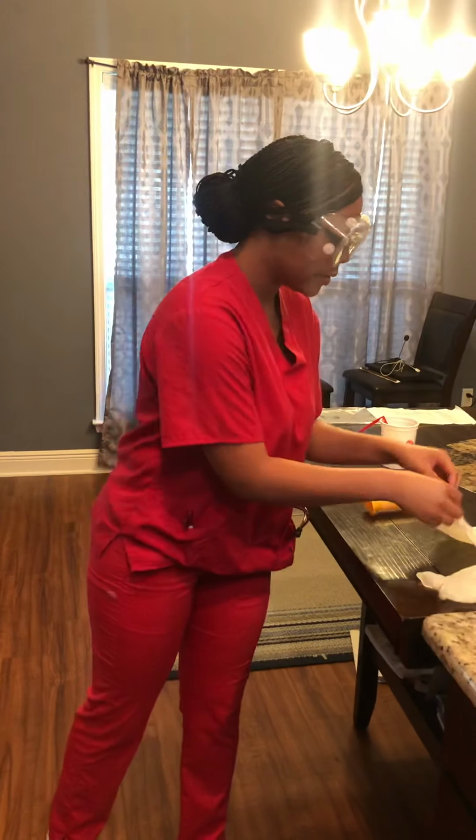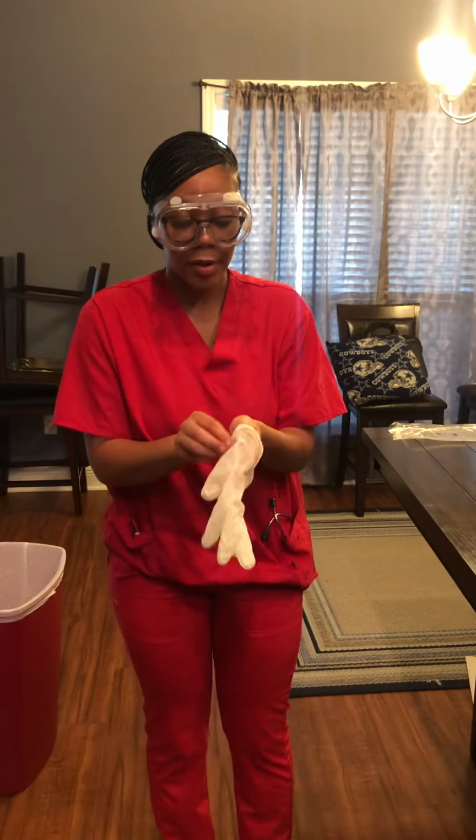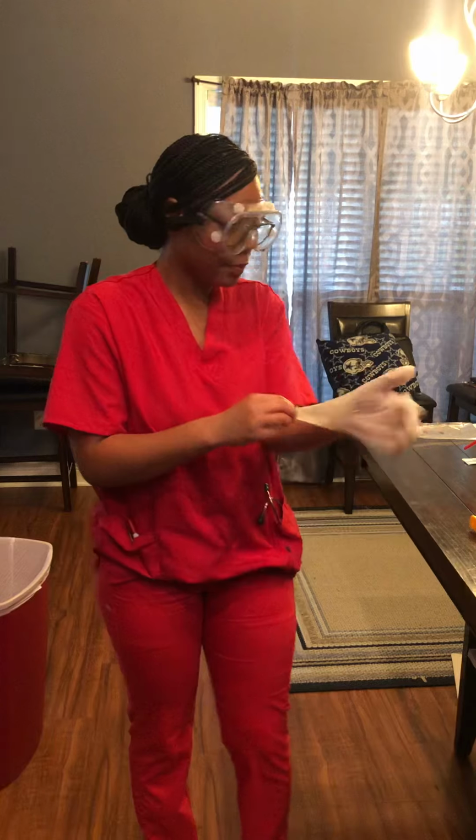For step 21, I will demonstrate the discontinuing of the NG tube by checking the order. I will then perform hand hygiene, don my clean gloves, and explain the procedure to my patient.